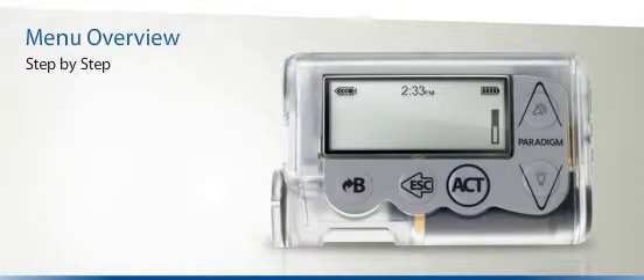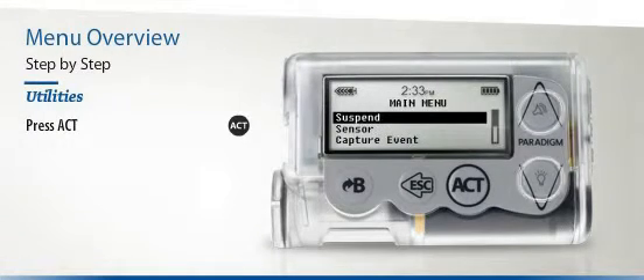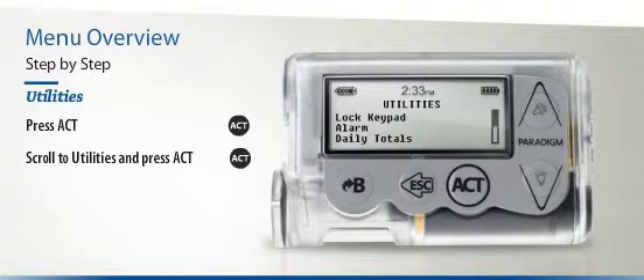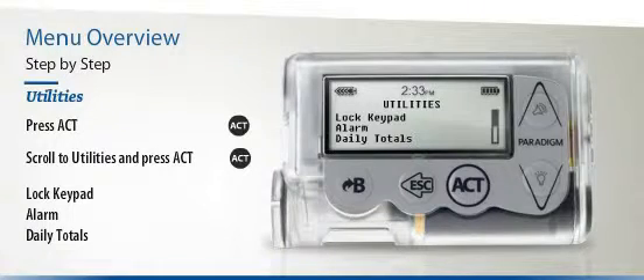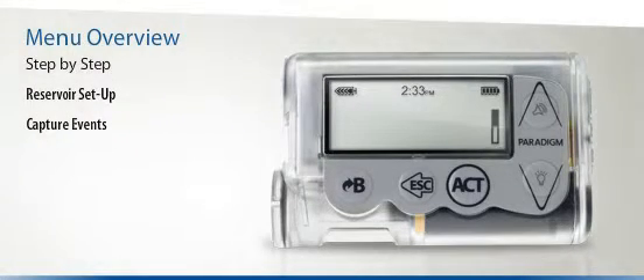As a final example, let's show you how to reach the Utilities menu. Begin by pressing the Act button once, then scroll to the Utilities menu and press Act again. You should now see a series of options including Lock Keypad, Alarm, Daily Totals, and many more. You can navigate in exactly the same way to reach the sub-menus for Reservoir Setup, Capture Events, Suspend, and Sensor.